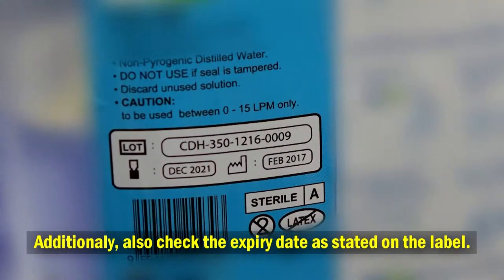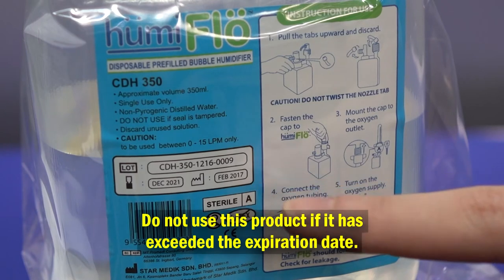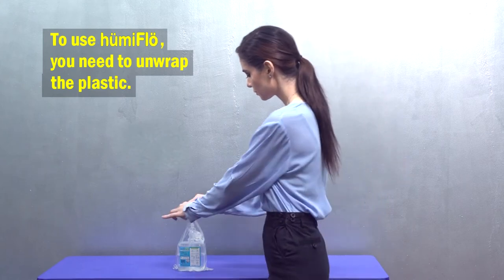Additionally, check the expiry date as stated on the label. Do not use this product if it has exceeded the expiration date. To use Humiflow, you need to unwrap the plastic packaging.